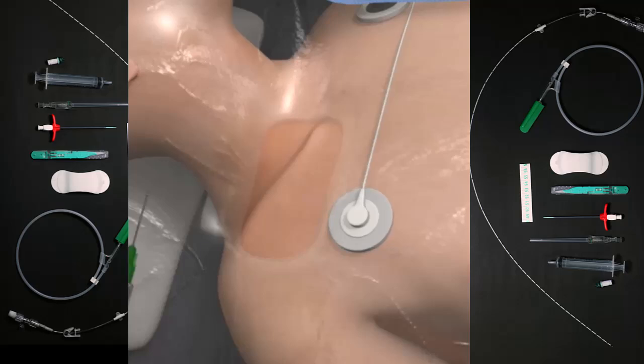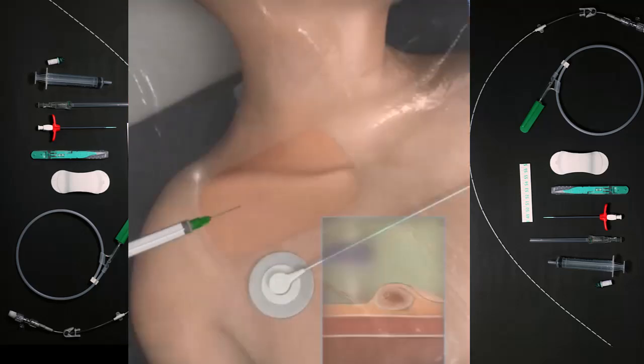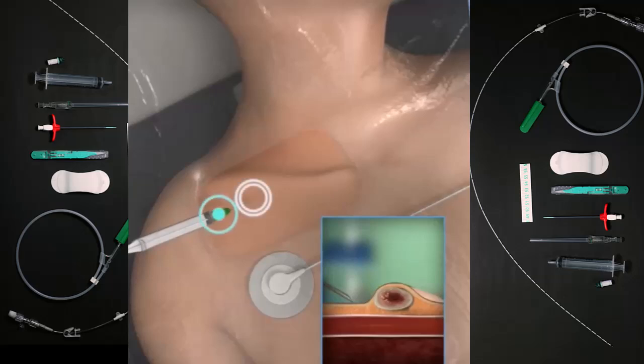Swipe to select the insertion needle with attached syringe. Orient the needle bevel caudally and at a 30 degree angle to the skin to facilitate guidewire passage. Insert the needle into the skin at the lateral border of the clavicle while pulling back on the plunger to apply negative pressure. Stop the needle when it reaches inferior to the clavicle.